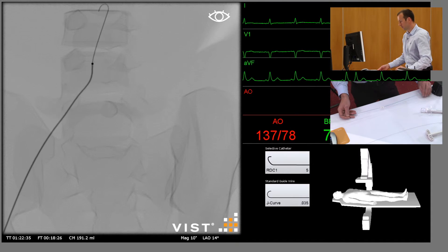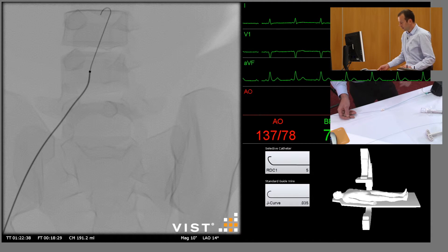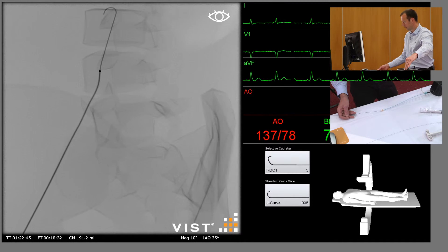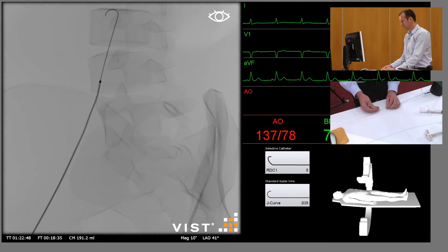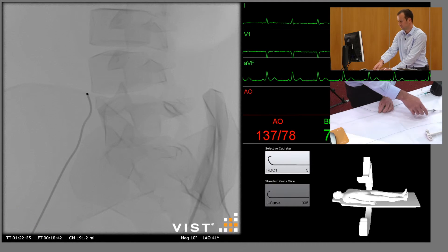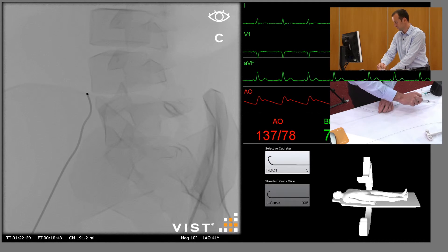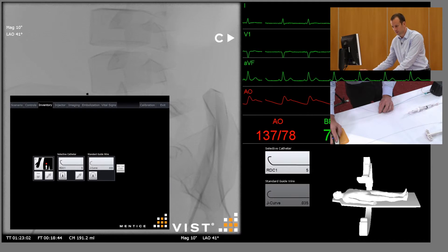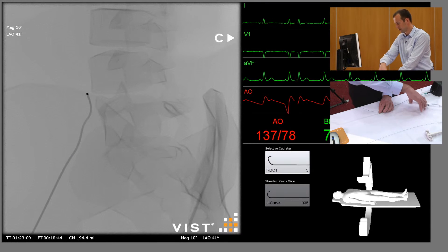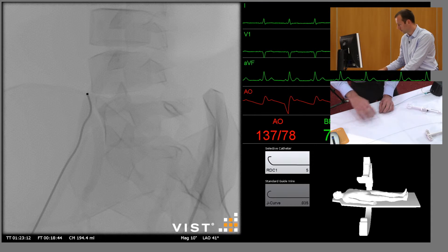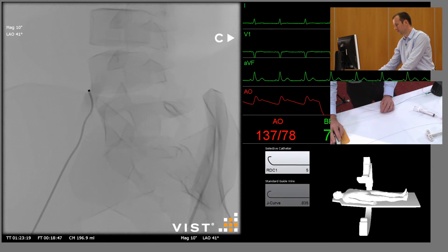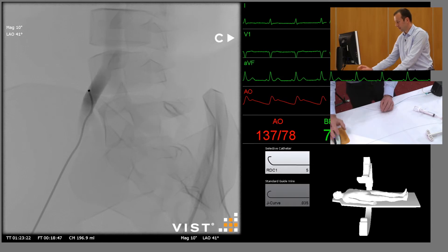Going to insert that over the guide wire up into the aorta. And again we want probably a left anterior oblique — it will give us the best imaging of the bifurcation between the internal and external iliac arteries. Remove the guide wire and perform an angiogram. Just make sure the wire is out. And we can see the bifurcation between the internal and the external iliac artery.